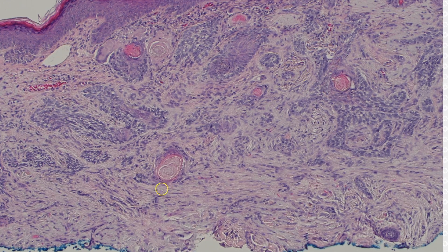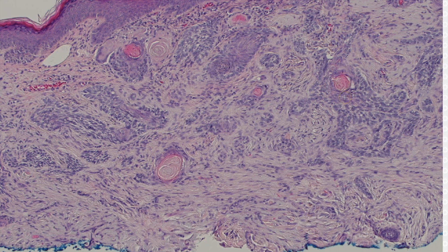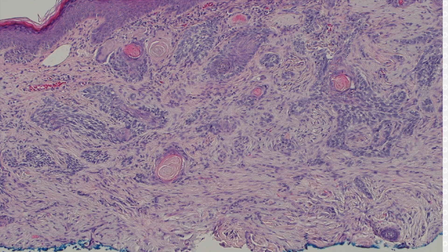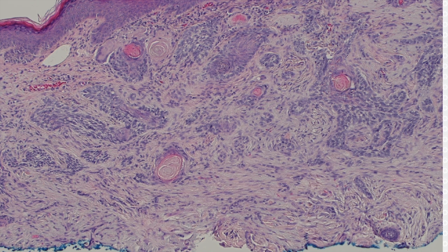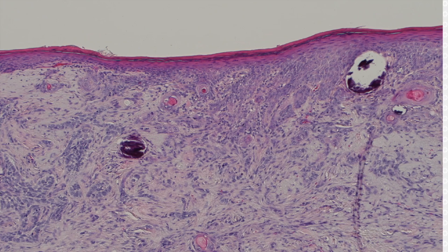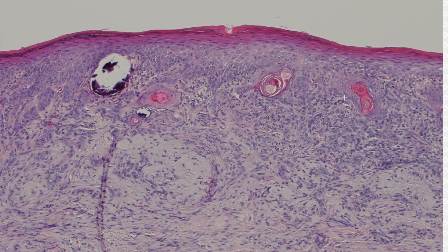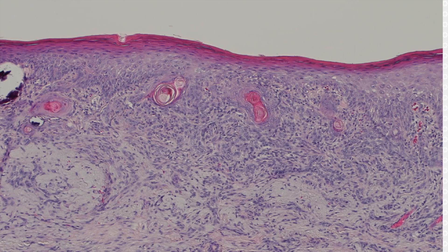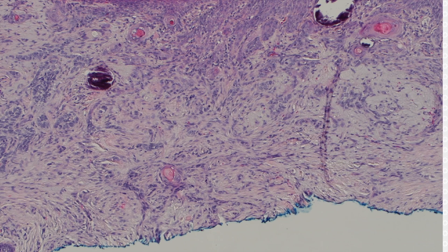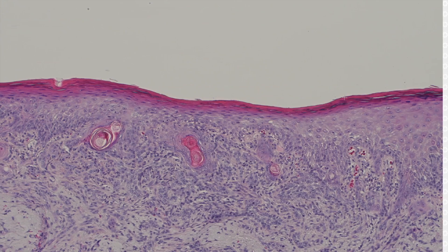You can have little keratin-filled cysts in basal cell — I see it all the time. Sometimes I'll even mention that there's some squamous or keratinizing differentiation, or squamous metaplasia. I don't think that's probably technically a correct term, but I do say that sometimes. The main reason I mention that is not because I think it means anything, but just so the Mohs surgeon, if they see keratinization, they know — oh yeah, this is not a squamous, it's actually a basal.